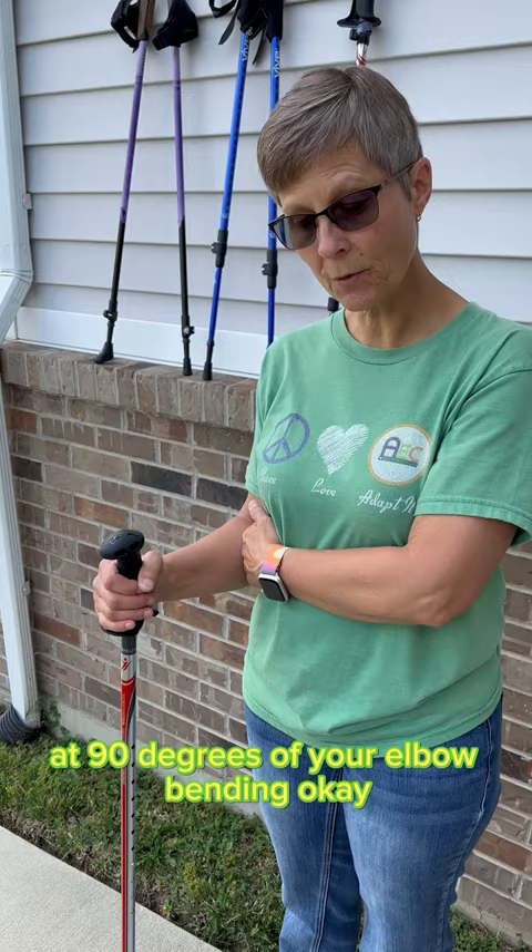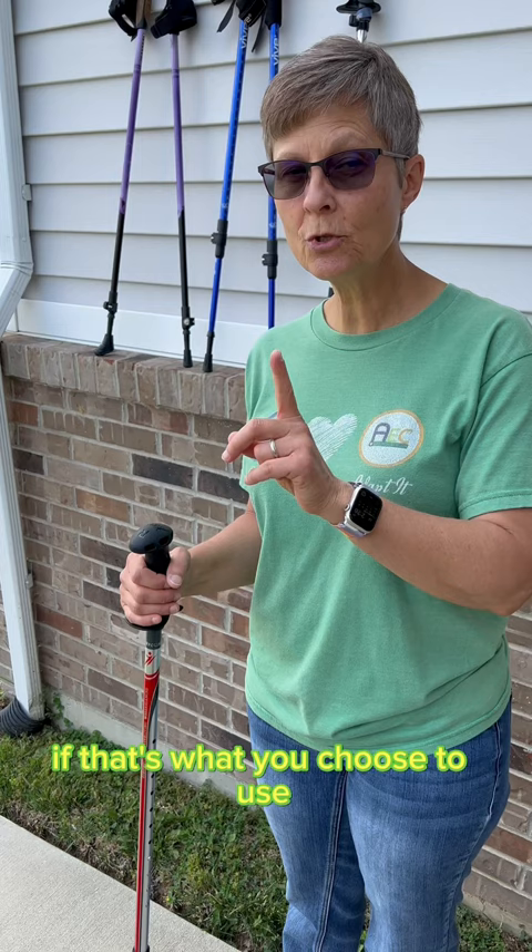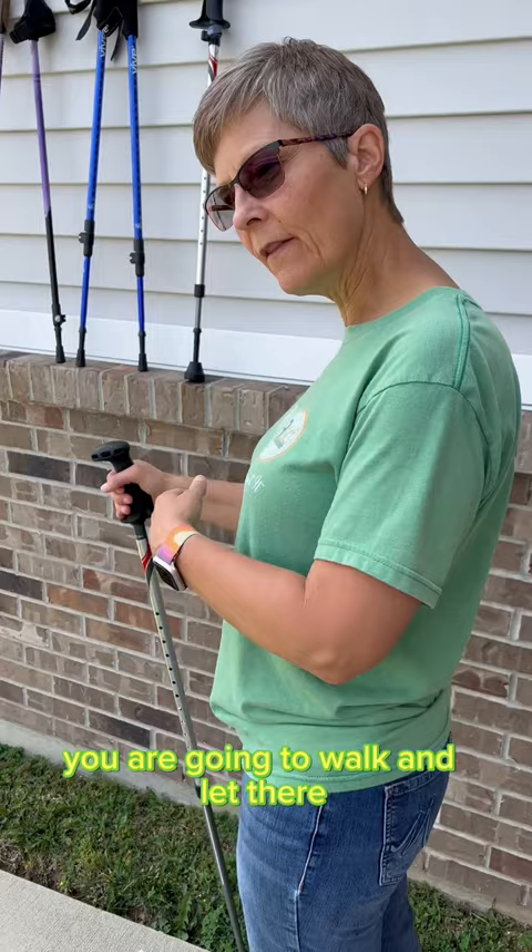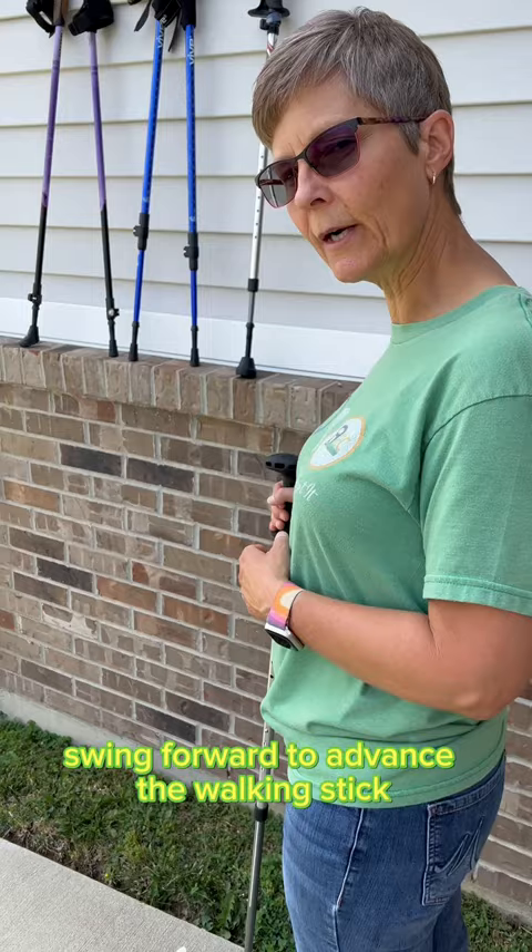If you need a cane and you choose to use a walking stick, you're going to use it on the side opposite the injured or weak leg. So let's say my weak leg is my left leg. When you walk with this, you are going to let the arm you're holding swing forward to advance the walking stick.